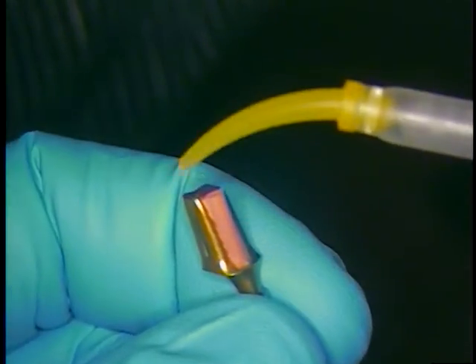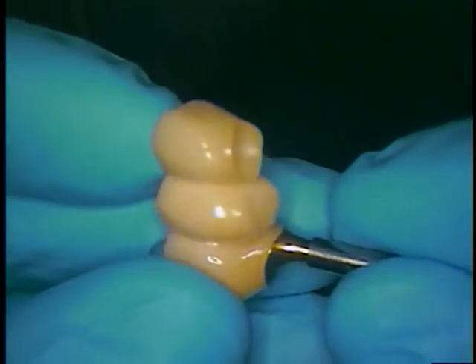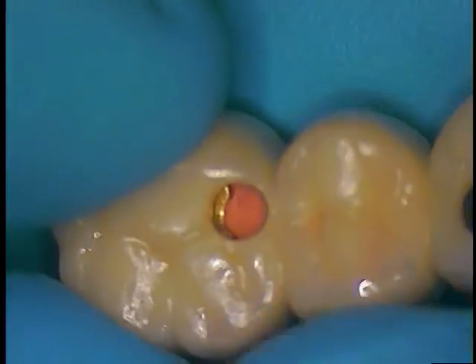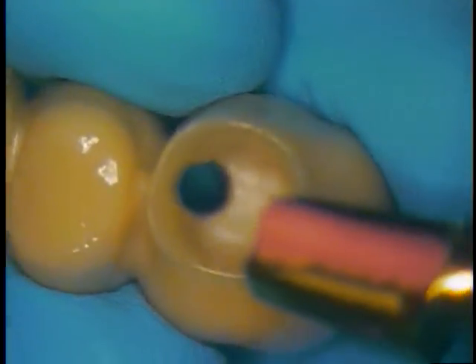I just inject a little bead in there. For this case, because there's more of a trough, not necessarily a hole, I had to reseat this back into the bridge. So when we go to cement that in, we'll cement it in and then remove the plug, and then the screw will be right down inside. That's how you don't get cement down into the screw access hole. If we didn't have that in there, cement would be very difficult to remove — it would be impossible.